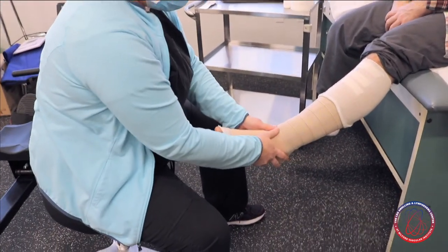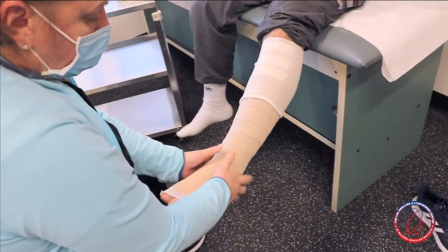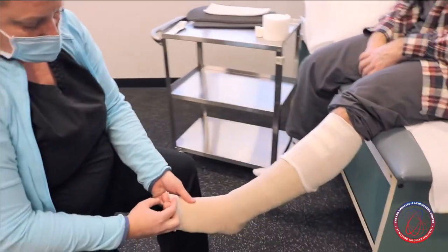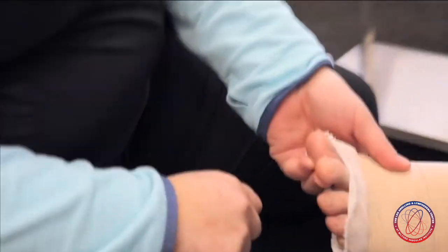I'm going to check to make sure that I feel a nice gradient compression as I go up the leg — more compression down at the foot and ankle and less as we go up. I'm also going to check circulation by checking capillary refill, and you can see it looks fantastic. How does it feel? Looks good.